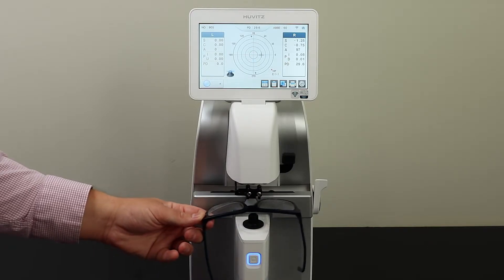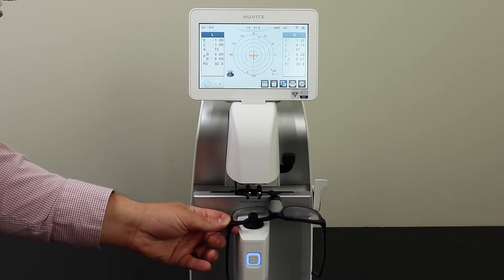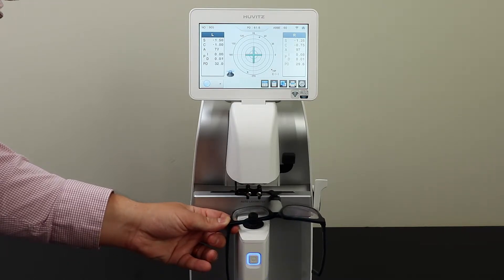Then slide your frames over. This will detect the left lens. Once you line up the orange crosshair again, press the blue button.